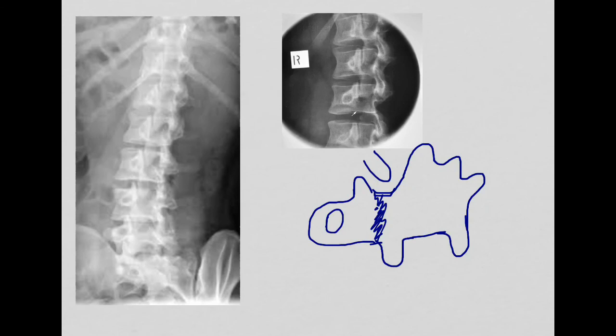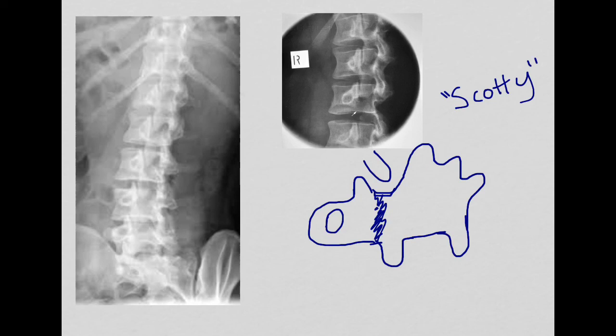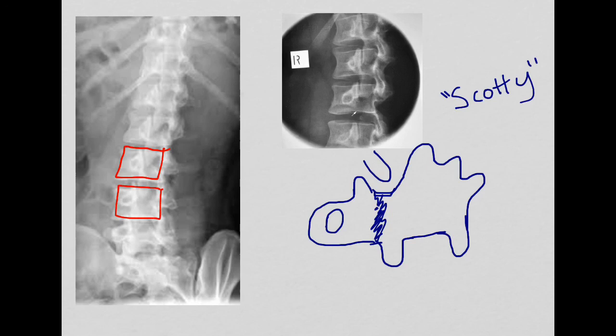Now we're going to take a look at the famous lumbar oblique projection, where we can identify our little friend Scotty. Scotty is going to tell us a lot about our projection and whether we've positioned correctly, because if we don't see him or if his eyes move to different places, we know we've done something incorrectly. I'm not going to spend a lot of time going over vertebral bodies because I think you have an idea of where those are — and within each one of those bodies, you are going to find our little friend Scotty.